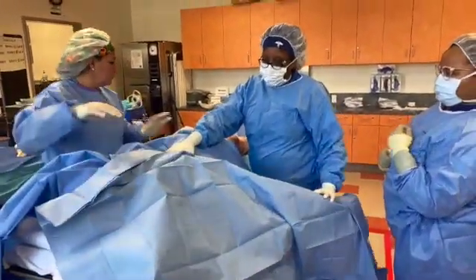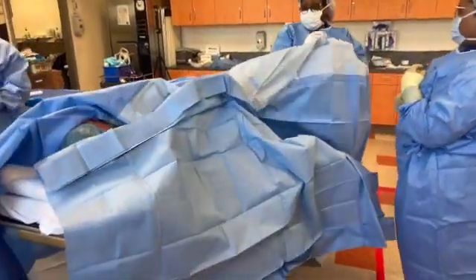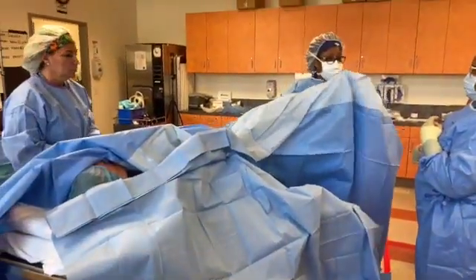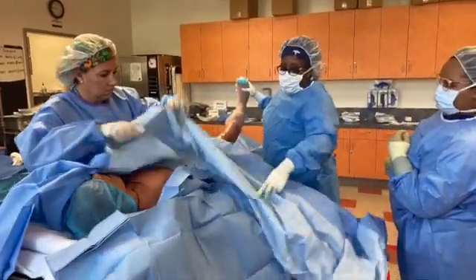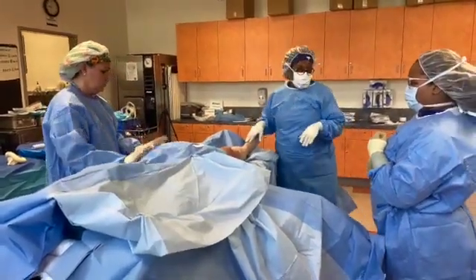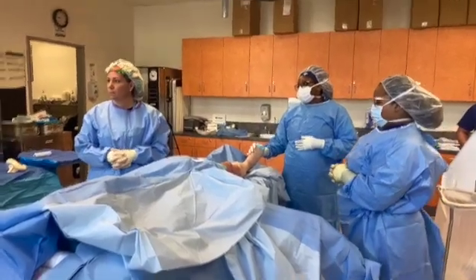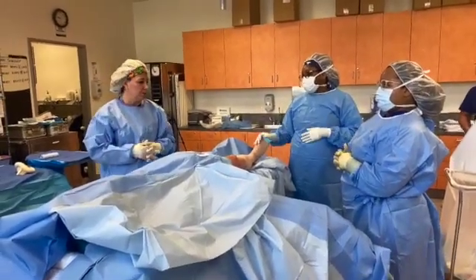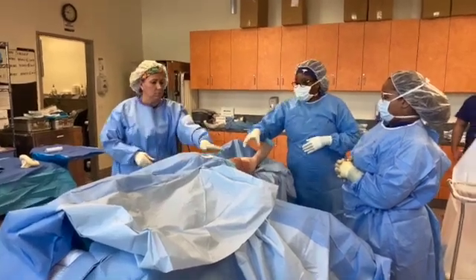So what should have happened? When you're grabbing it, when me and you switch places, you're grabbing everything. I'm holding up and then you're coming over. Okay? Great. Places split drape correctly, tails down, 5 to 6 inches above the knee and secures the adhesive edges. Unfolds the remaining portion before the patient's head.